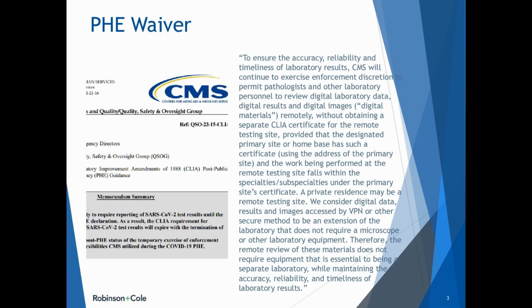We saw recommendations over the last year from CLIAC on how CLIA could be updated, particularly around digital pathology, with topics of discussion centered around data processing and quality management issues, particularly with turning slides into digital and then reading and how long you have to keep the slides and what that looks like.